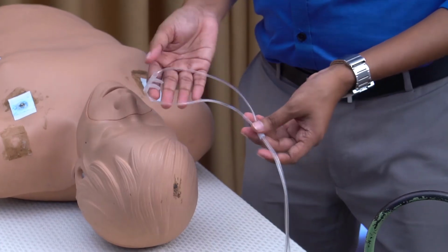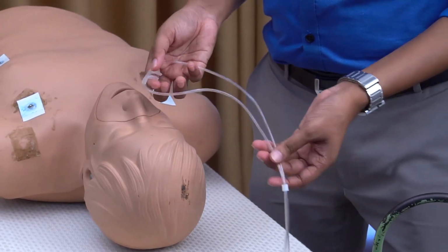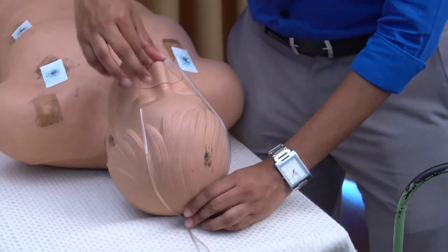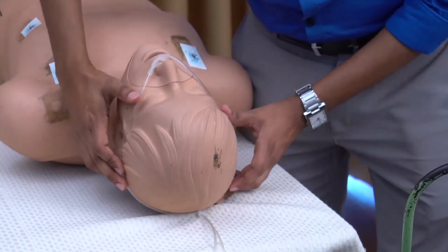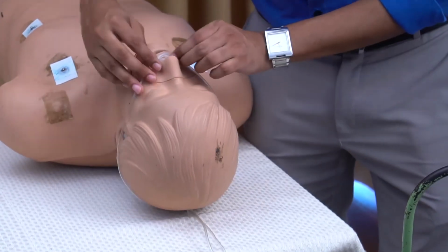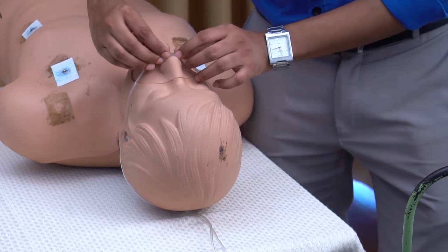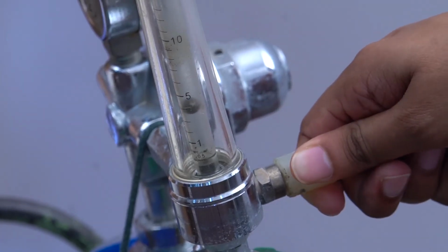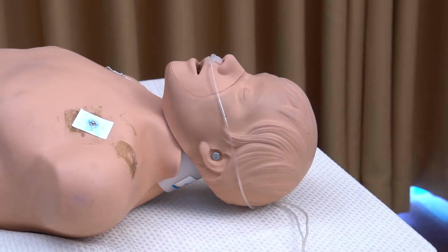This is nasal prongs, which can be used to give low flow oxygen to the patient. Up to 5 liters per minute of oxygen we can supply via these nasal prongs. Above 5 liters per minute, airflow is uncomfortable to the patient. So this is good for low flow.